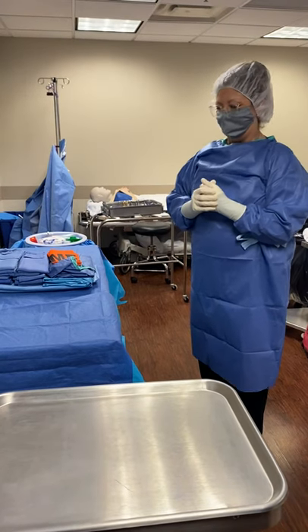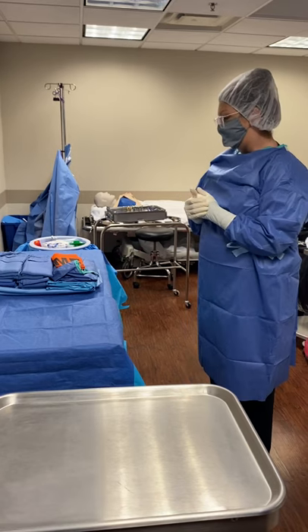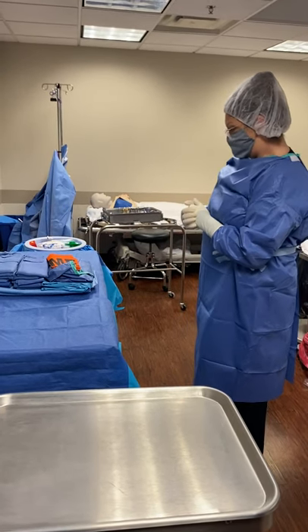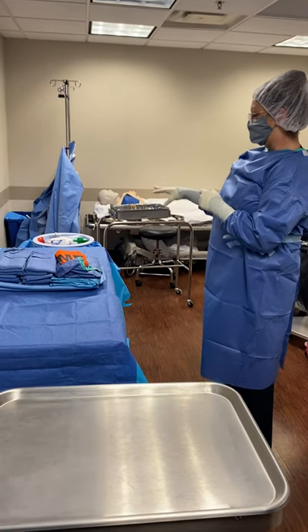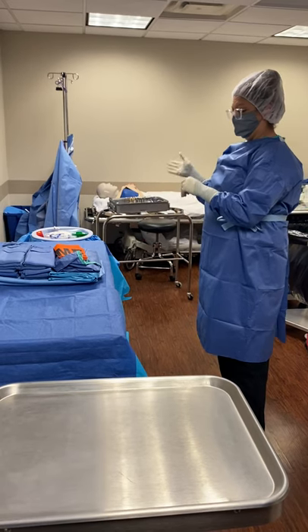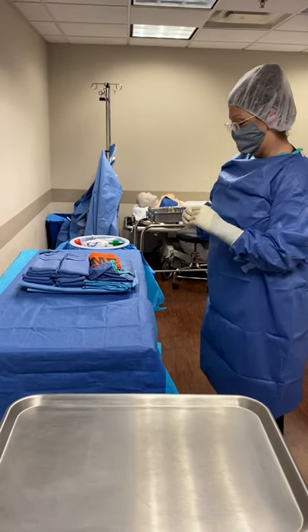Hi, I'm Amy and I'm back to finish setting up my sterile field for you. I'm going to begin with my back table and move on to my mayo stand table setup. And here we go with the process.